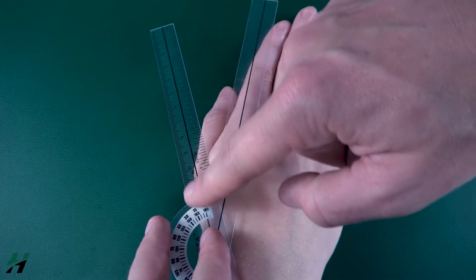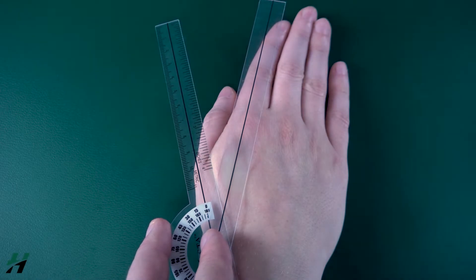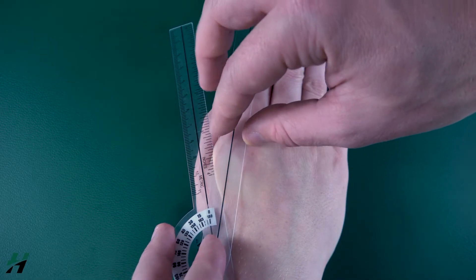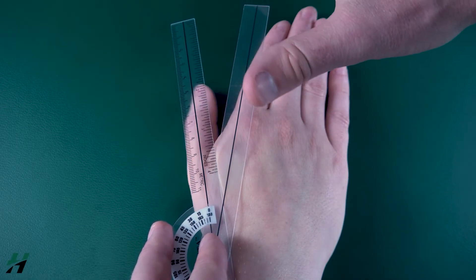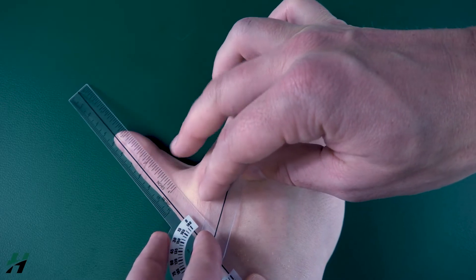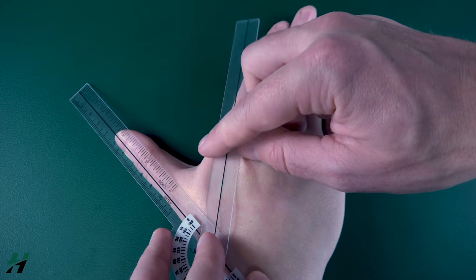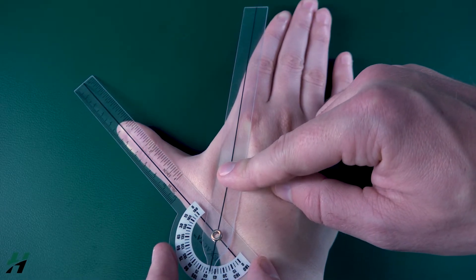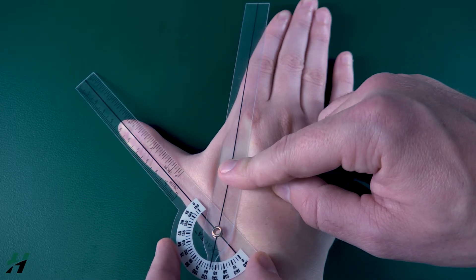The movement arm we're going to line up with the shaft of the first metacarpal. Rachel, bring that thumb out as far as you can. We are looking at 50 degrees for this measurement, which is quite common.